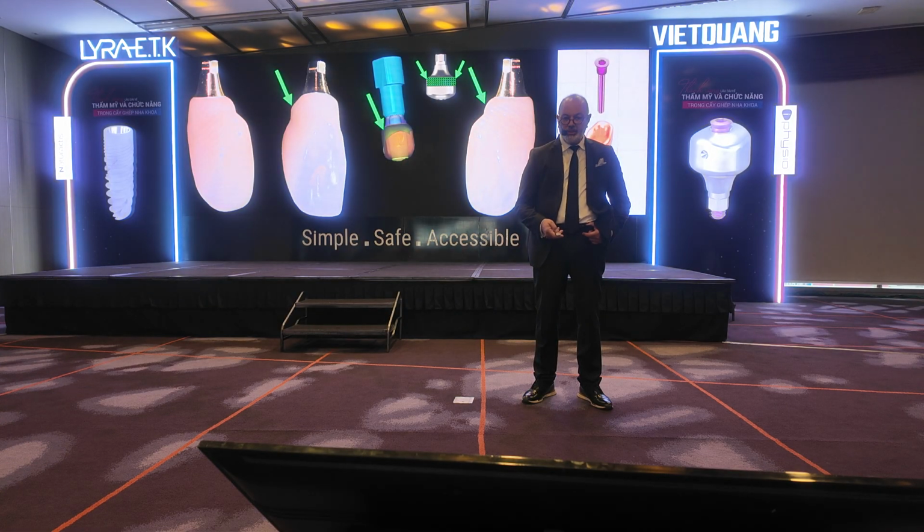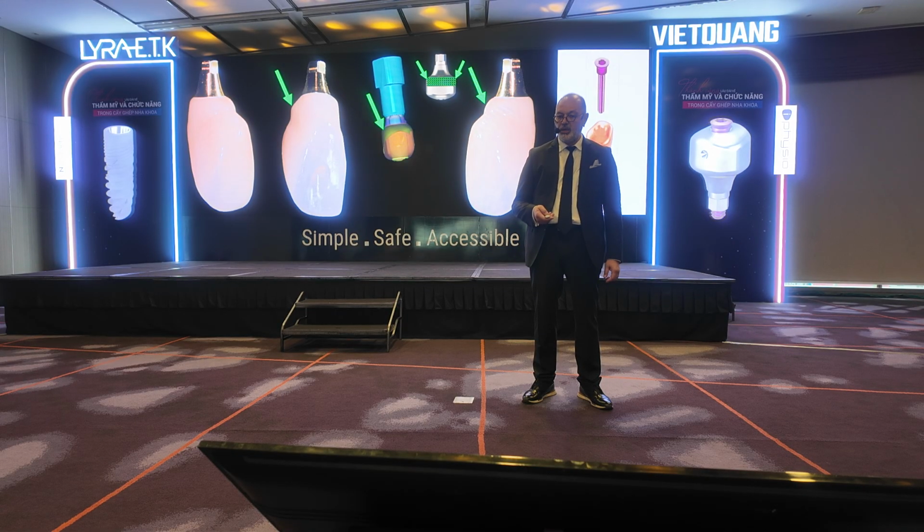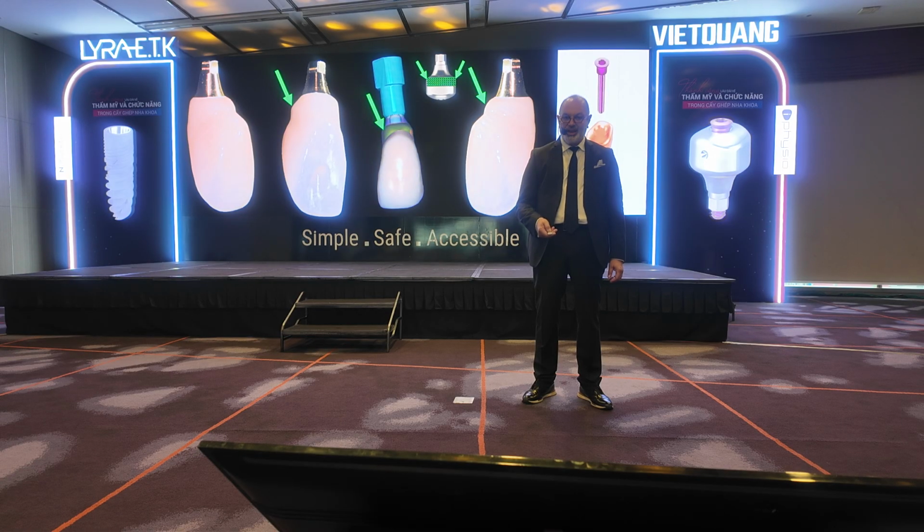So what is interesting is that the fact that we do not remove this healing abutment gives us the possibility to have in the library the copy of this abutment being the base of the crown. And this is how it looks.